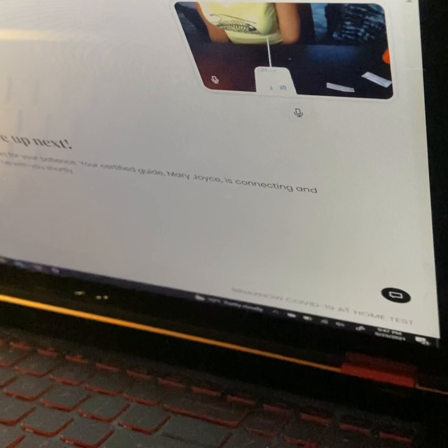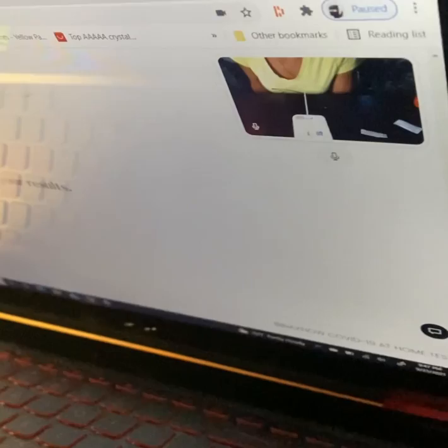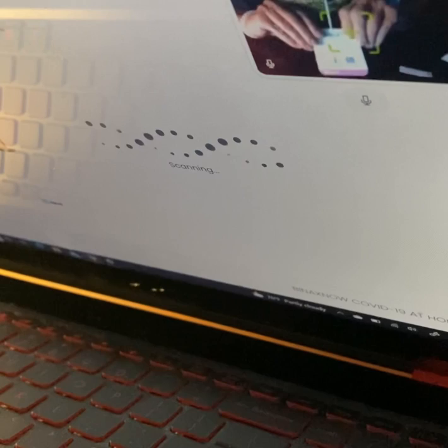Hello, thank you for waiting. My name is Mary Joyce. I'll be a certified guide. Together we will interpret and record your results. Wendy, please hold your test card in front of your device camera to scan the QR code so I can see the results. Please hold it right side up. That is upside down. Turn it around.